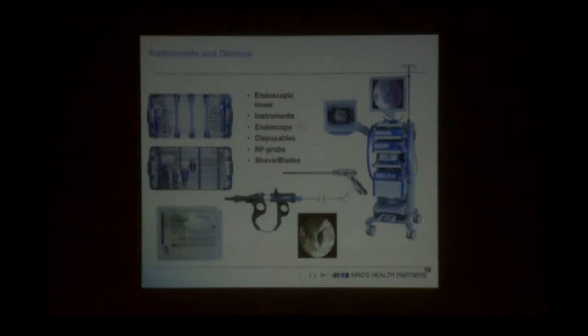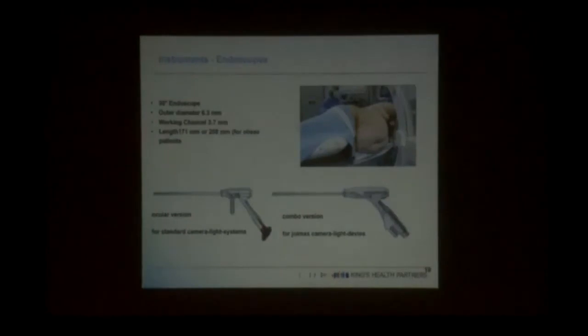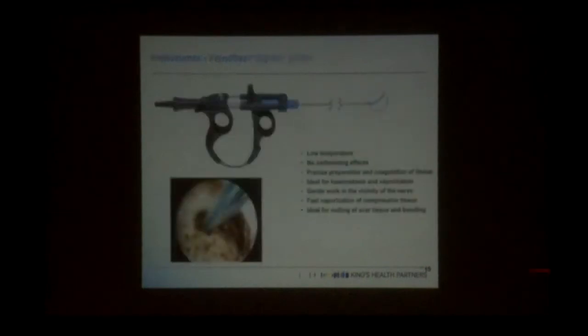So there are different kits available in the market. I use the Joymax. That's the only company that works only on spine endoscopes. And they have a lot of innovation and research, bringing new equipment and instruments. So this is the endoscope which goes transforaminally, 30 degrees. This is what we call a bipolar.